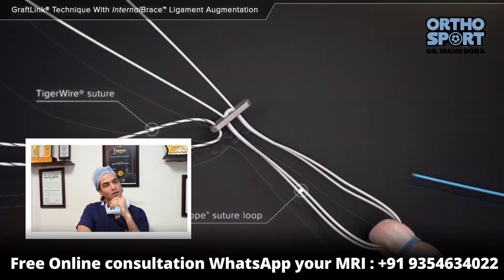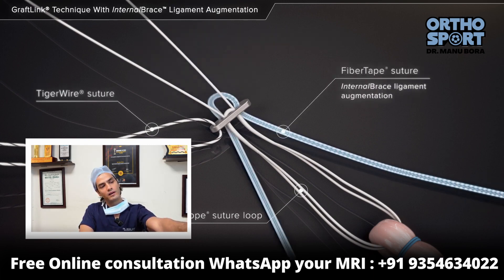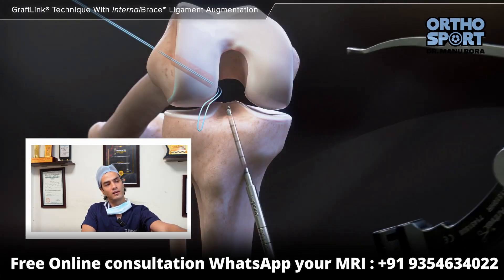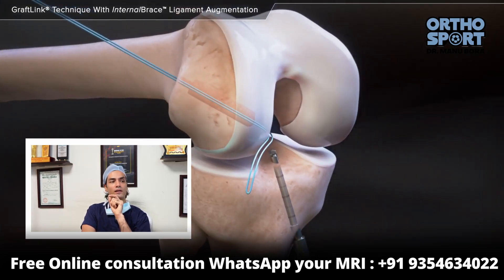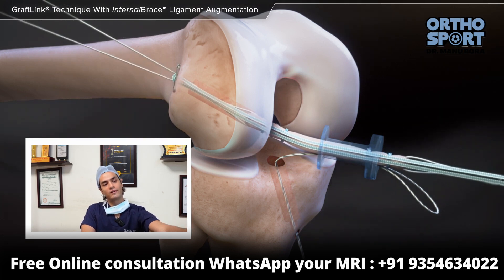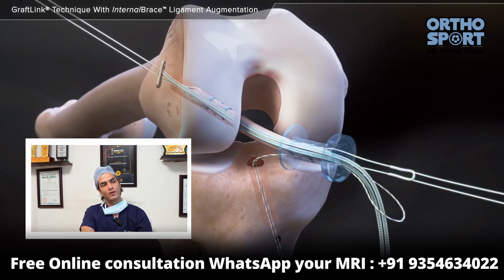To get the button into the bottom of the graft-link construct, the graft is not cut off. The flip cutter will open and close around the graft. The graft is reduced and then we put the button tight. If you look at the construct, the button is small. So the button is fixed and will tighten automatically.